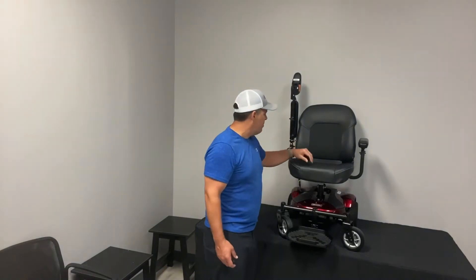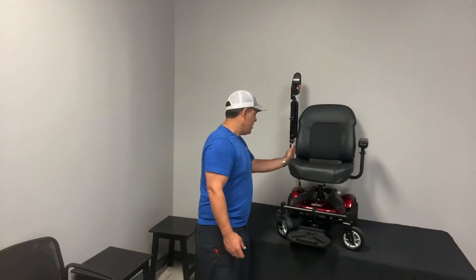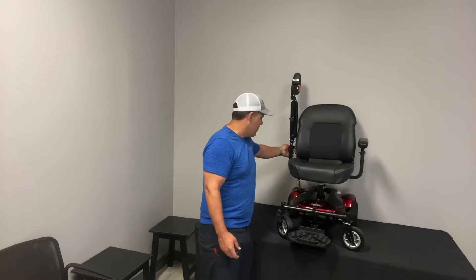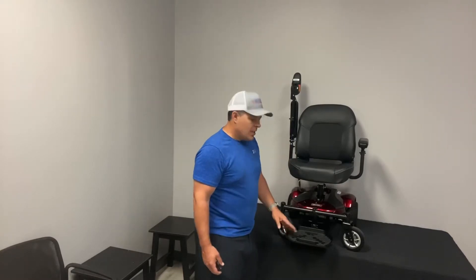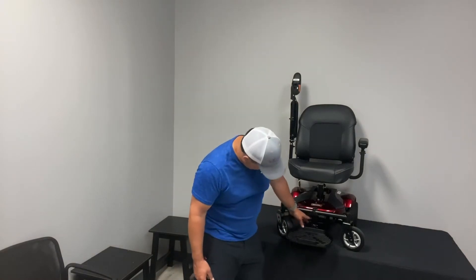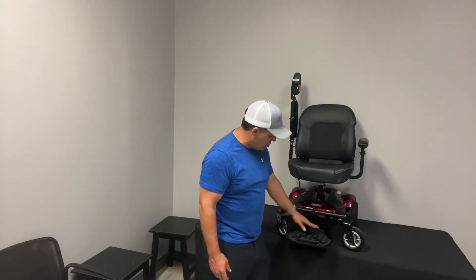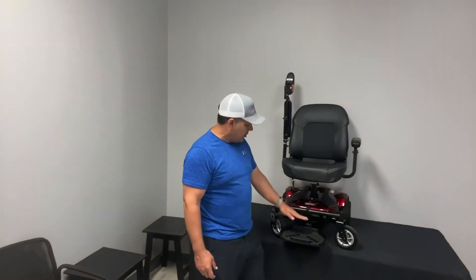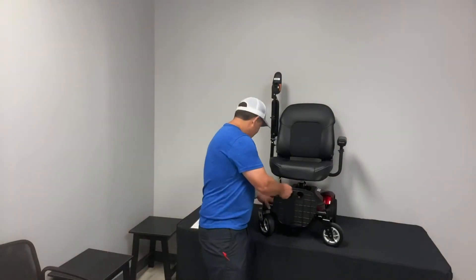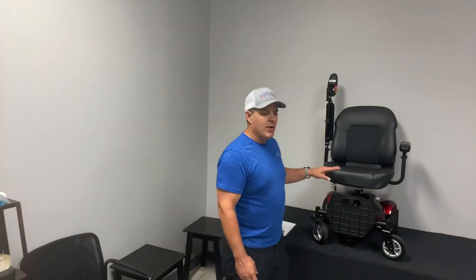Your armrests can be flipped up, and they can also be adjustable in height and width. There's a little knob here that you can use to make those minor adjustments. The footplate has about four adjustable points — you can raise it up if you're a little shorter. It also folds up out of the way, so it's got a lot of nice features and benefits.